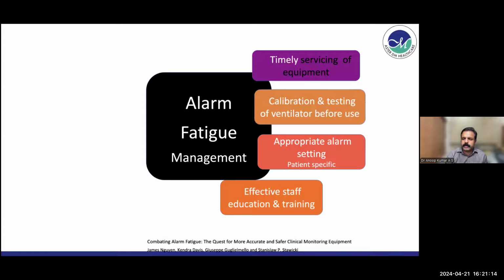So at that point, especially with patients with severe ICU-acquired weakness or recovering patients with Guillain-Barré, C-spine injury, etc., sometimes in the ward the relatives or the bedside staff may not detect a power disconnection, etc. And in the middle of the night, it can go for a complete shutdown and can have a severe deleterious effect on the patient. Sometimes we can even lose that patient.